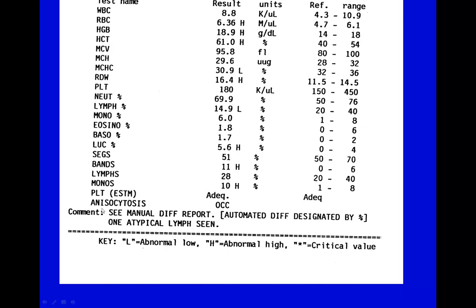I do have anisocytosis. So they have some that are a different size and a different color. They have an occasional one of those. We look here then, what's going on with the patient? Well, their neutrophils are within the normal range, except if I split it out into the bands and the segs. Look at this, the bands are elevated.